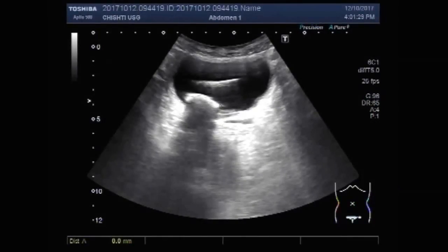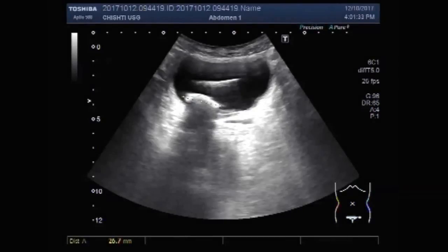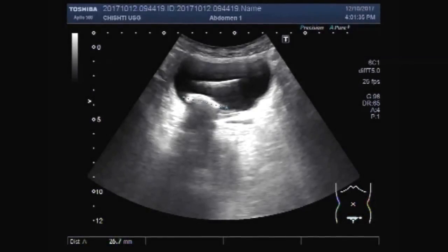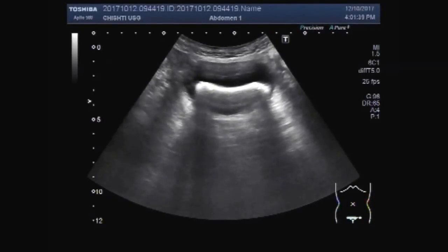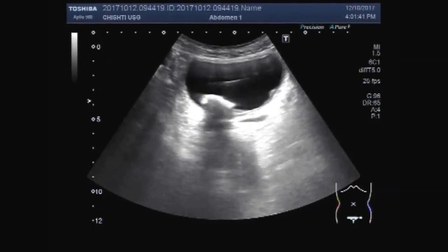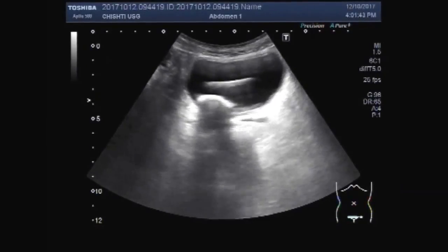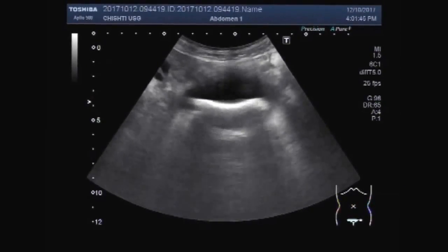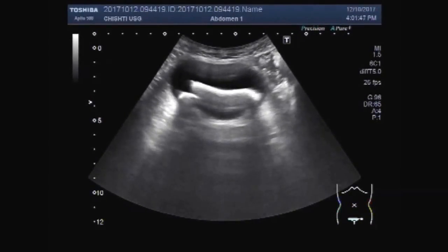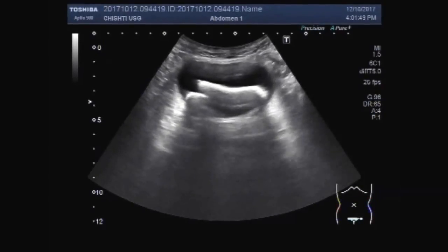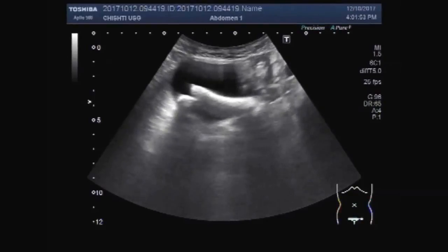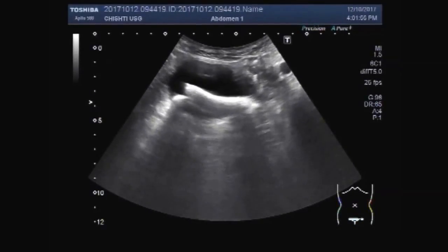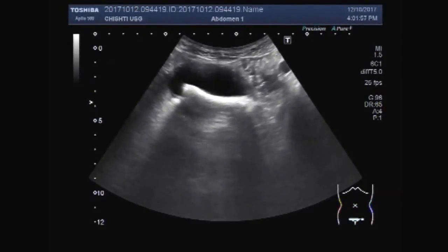The smaller stone measures about 26.7 mm. It is not a small stone, but it is the smaller of the two stones seen in the urinary bladder. A small amount of thick sludge is also seen inside the urinary bladder.